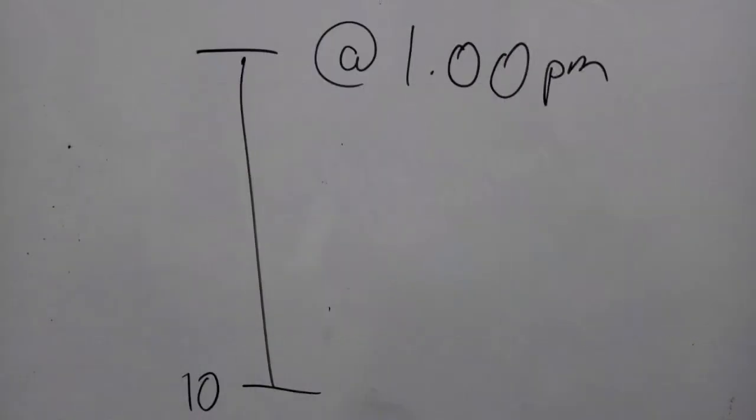Now, because we are interested in Charlotte's left eye, we record the results obtained from that as per the template. It is also important to write the time of the day in our recordings. This is due to diurnal variation. Diurnal variation means that the IOP shows fluctuations at different times of the day. In a healthy individual, IOP is found to be highest in the morning and lowest late at night. These diurnal variations are due to aqueous humor production in the eye.